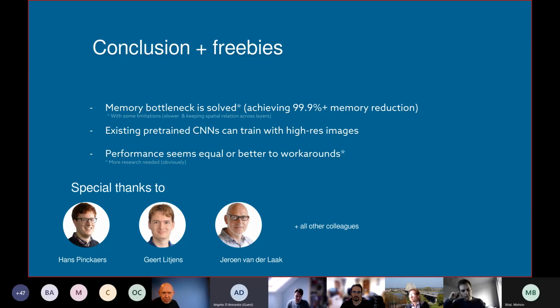For example, if you want to do brightness augmentations or stain augmentation or color jittering, these kinds of augmentations you can do on those tiles when you're streaming, if I'm not wrong. Just some sort of suggestion, or to see if you have ever tried that.